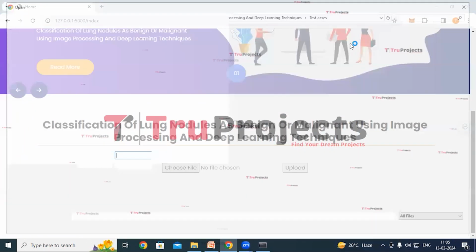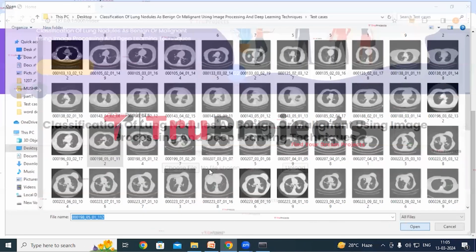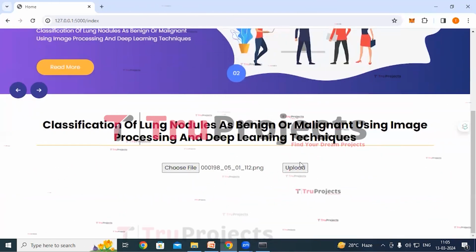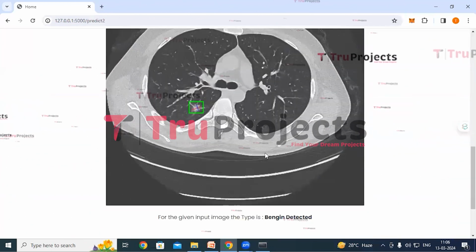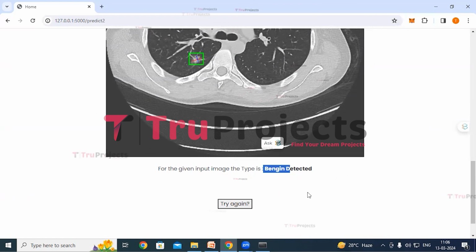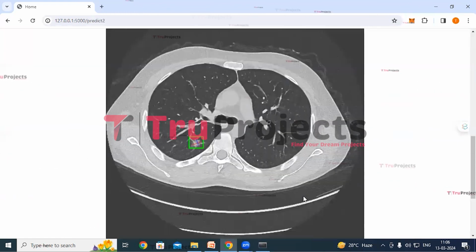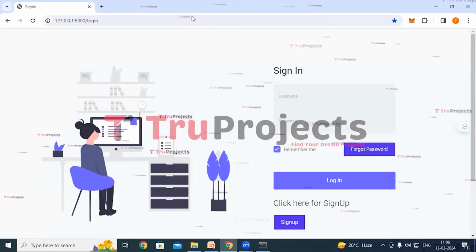Click on try again button. Choose the file. I'm selecting this one and click on open. The image is loaded. Now click on upload button. This is the uploaded image and here we can see the classification type, that is benign again. Now click on sign out.